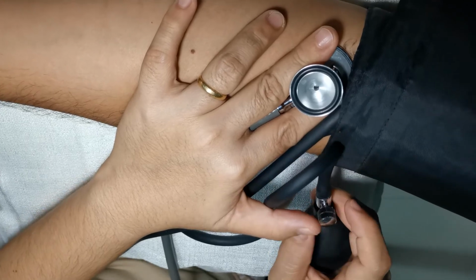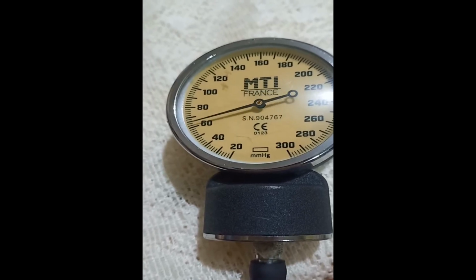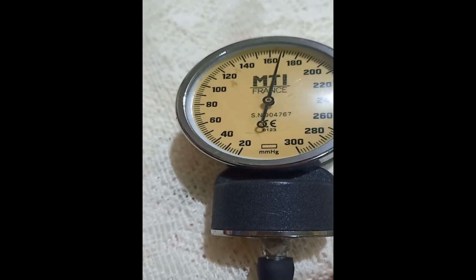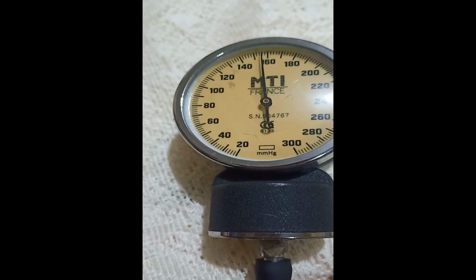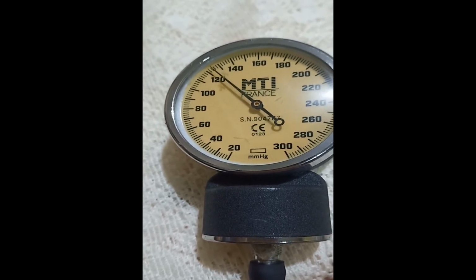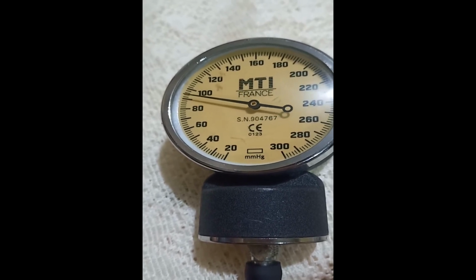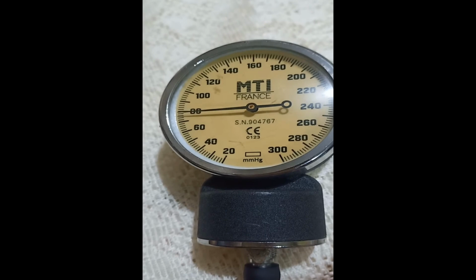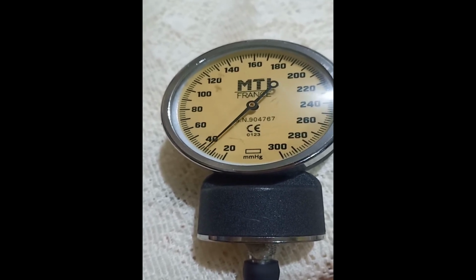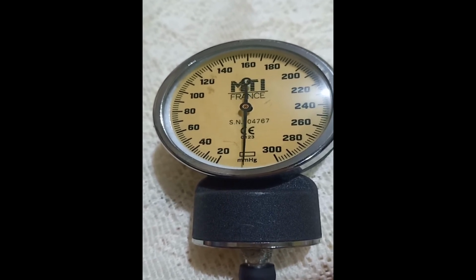Let's take a look at it. That is the first beat, which is the systolic. It falls on 110, and the last beat at 70 mm of mercury. The blood pressure is 110/70.